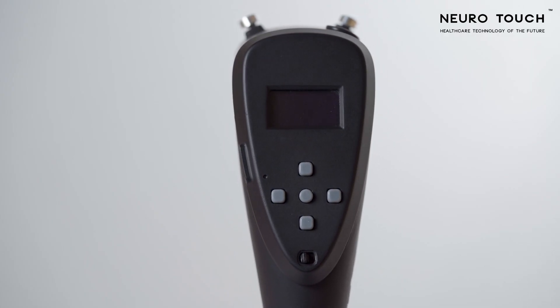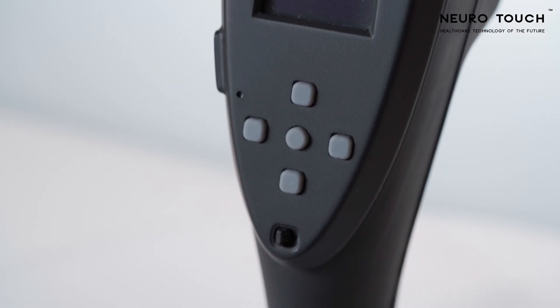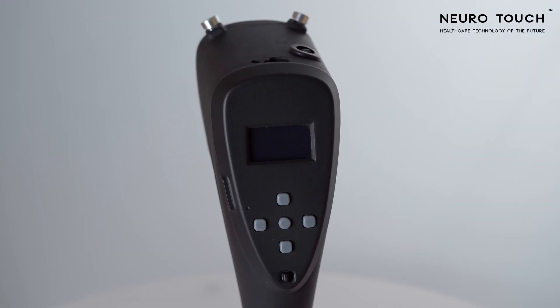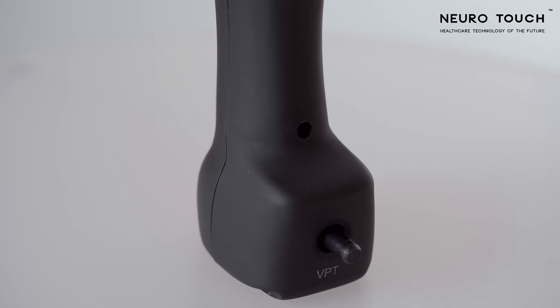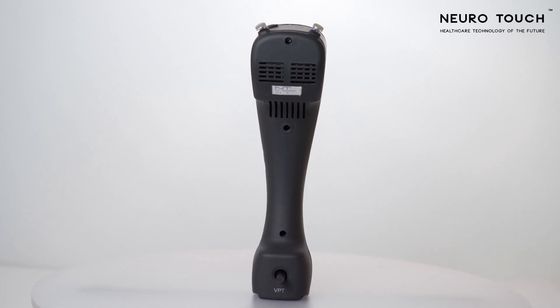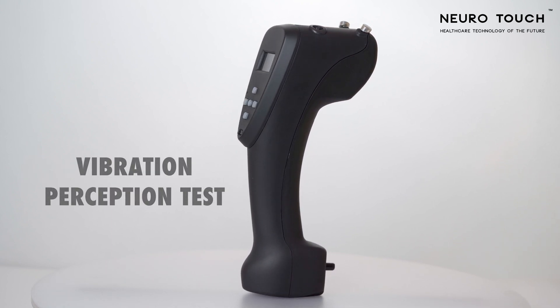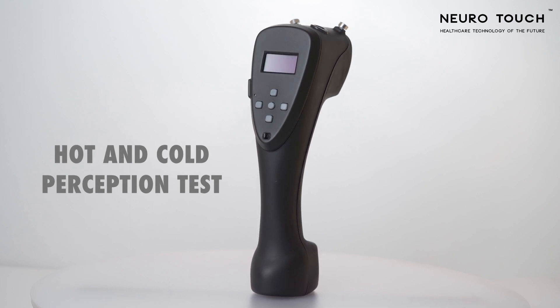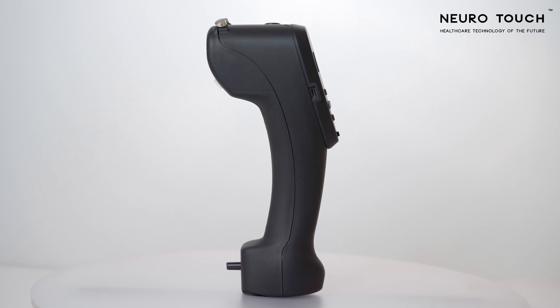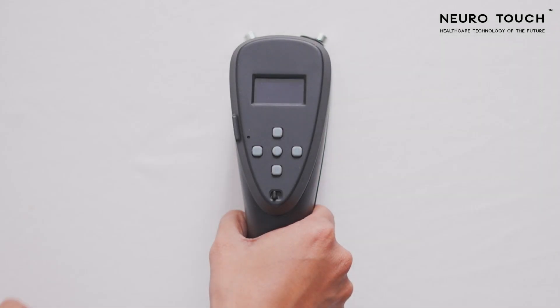NeuroTouch is a handheld portable peripheral neuropathy screening device that enables the user to perform small and large fiber neuropathy tests according to the American Diabetes Association guidelines. The tests include the monofilament test, vibration perception test, hot and cold perception test, and foot temperature measurement. In this video, we will demonstrate how to use the device.